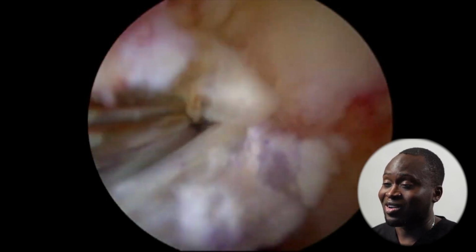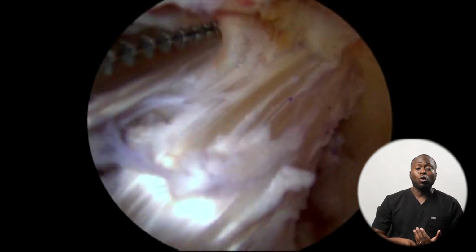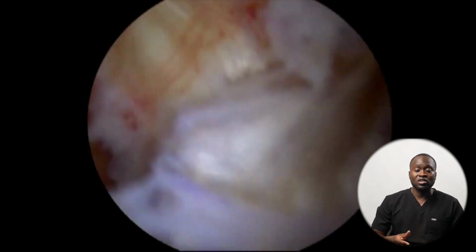So we prepared the graft already. You didn't see that part. We prepared the graft already, and we're gonna use the stitches, the suture that we passed through the tunnels to pass that through and pull it through. So we're literally pulling that graft through the tunnels to fill the space where the old ACL was.